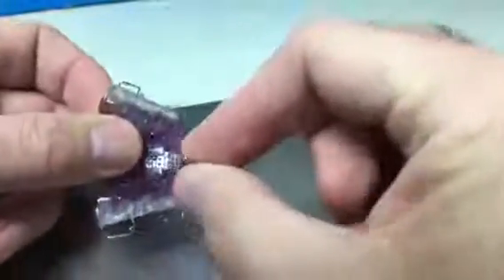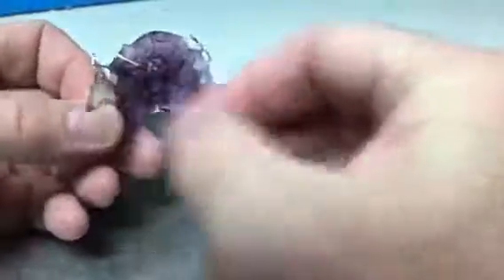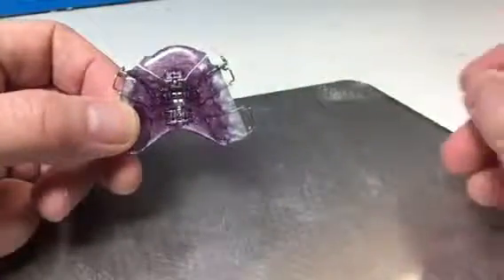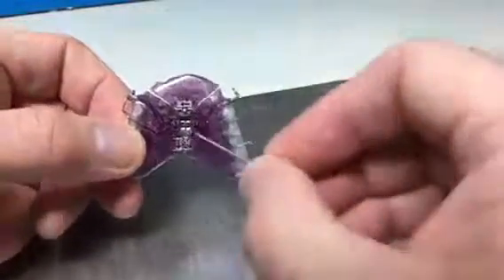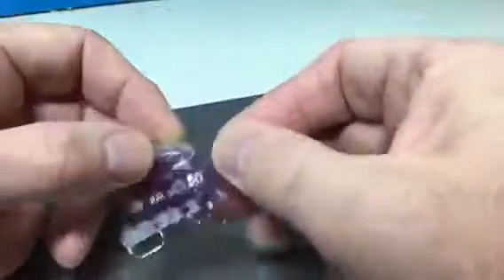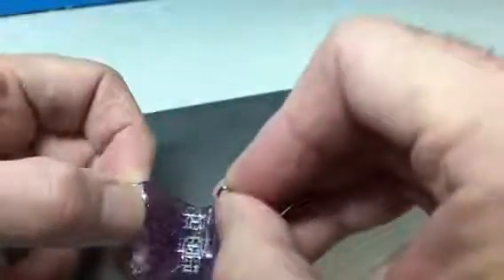We take the key, put it in the little hole and move it in the direction of the arrow so that there is one quarter turn. With cases like this, the front section should be activated for a month before you start activating the two screws behind that. But again, once you have activated that front section, it's just a case of putting the key into the little hole and activating it in the direction of the arrow.